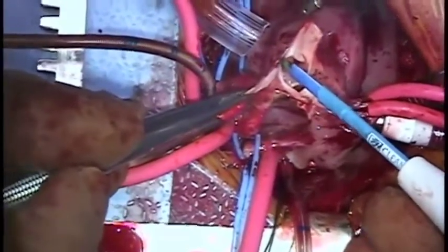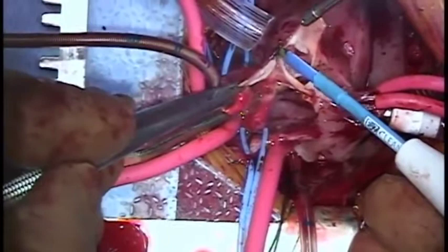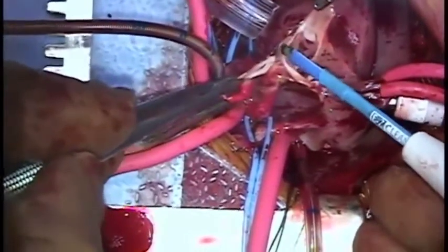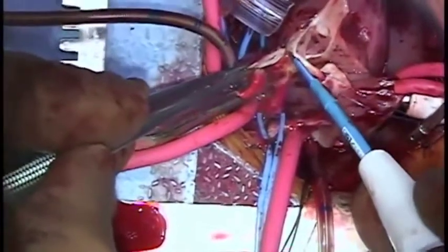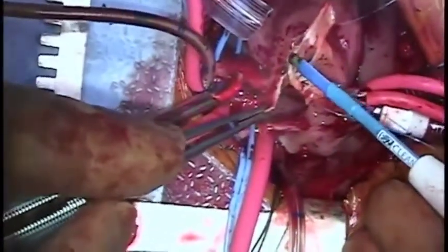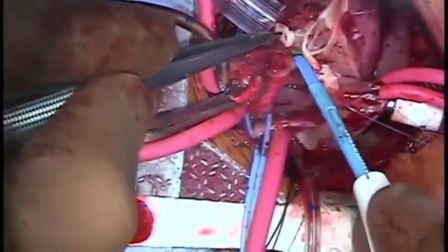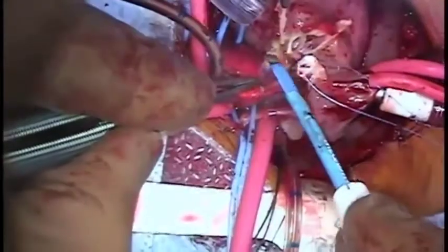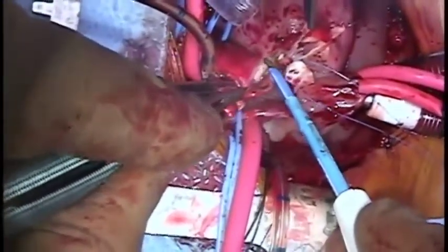Electrocautery is used in the coagulation mode. The machine is set to desiccate at an energy level of between 10 and 15. If the energy is set too low, it will cook the tissue rather than dividing it. However, if it's set too high, tissue division is difficult to control. Use of the yellow button in the cut mode gives inefficient coagulation of chyle vessels and collaterals. Note that the diathermy tip is Teflon coated and insulated almost to the end.